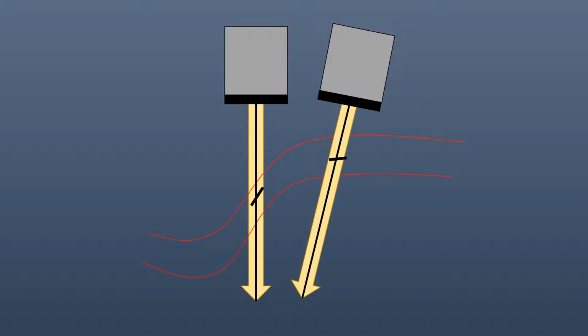So the last couple of slides, we were living in the perfect world in which the frequency that was transmitted from the transducer traveled in a parallel plane to the red blood cell, and then the received echo bounced back in a parallel fashion as well. Well, we know that's not the reality of life because, as you can see here, blood vessels can be very tortuous, which creates all kinds of angles that we have to deal with and work around. Next couple of slides, we're going to talk about the Doppler equation and the angle of incidence and how those affect the measurements that we take.